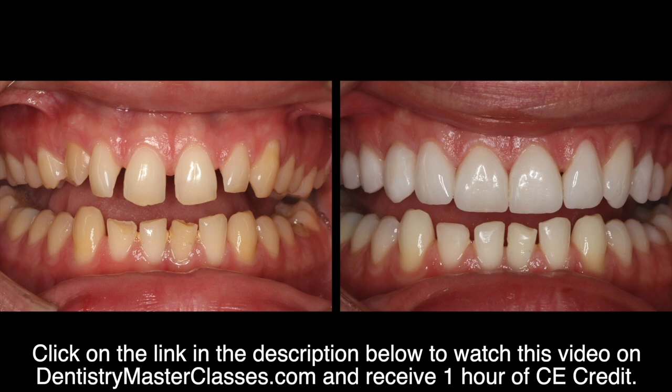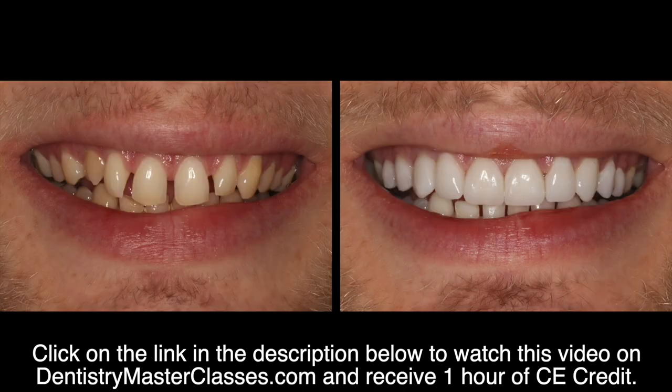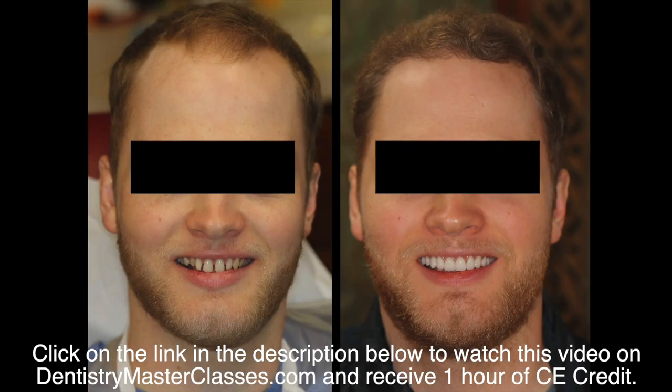So this is the final restorations. This is after the restorations have been in the mouth for a week. See, the gingival tissue recovers perfectly.